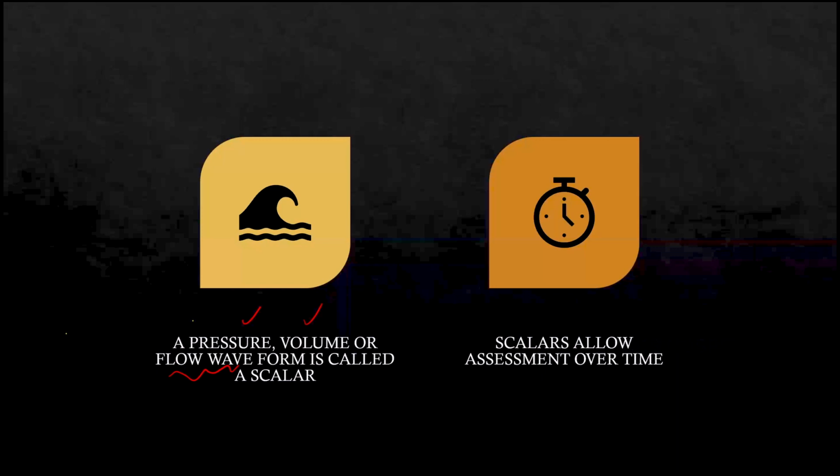axis. So in other words, when we talk about ventilation, whatever the different kinds of modes and different kinds of newer techniques of modes of ventilation which the companies come forward with their marketing strategies, it is important to understand that fundamentally there are only three things which are happening: pressure, volume, and flow. It is the different dynamics of these three variables which determines the different kinds of mode. And of course, that in various combinations is what we are going to do.